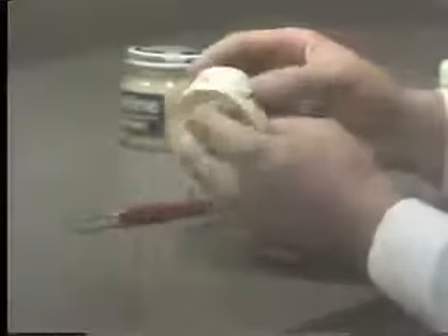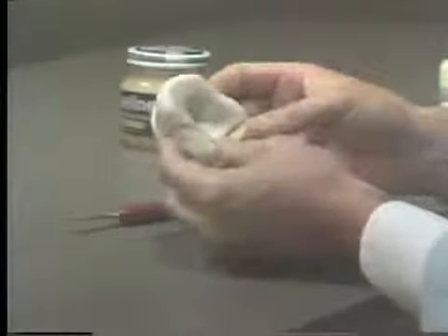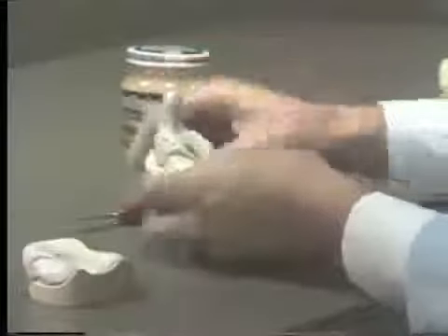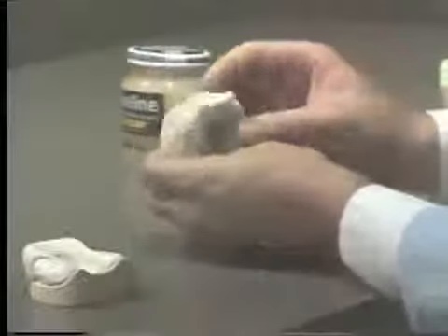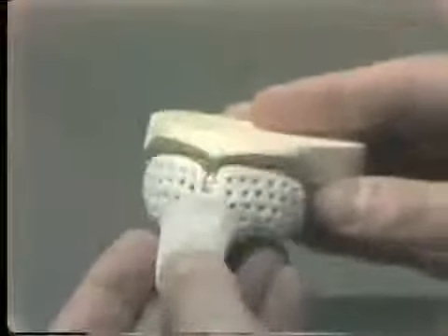After this second tray is made in Forma-Tray, it again is trimmed and polished to the proper peripheries. And then as a last step, a handle is added to the anterior portion of this tray so that the tray is easily handled by the operator when it is taken to the mouth.